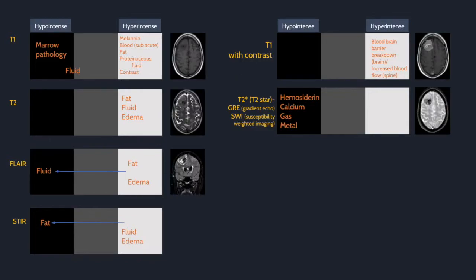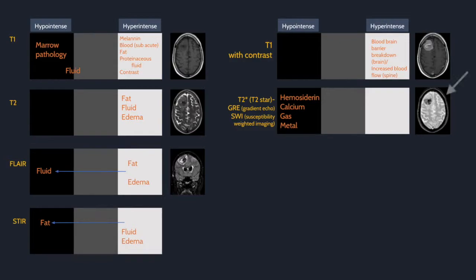Here are multiple axial and one coronal image of the brain. In this T1-weighted sequence, the subcutaneous fat and fat in the marrow are bright, but the fluid is dark, and gray matter is darker than white matter. We see a mass in the right frontal lobe altering the local anatomy. With contrast, the mass is much brighter due to blood-brain barrier disruption, and the superior sagittal sinus is bright as it is filled with contrast. On T2, subcutaneous fat and marrow are still bright, but fluid is bright as well, with areas of increased signal near the mass that may be fluid or edema. The coronal FLAIR shows increased signal near the mass persists, while fluid in the ventricles is dark, suggesting edema. T2 star shows focally decreased signal — a blooming artifact — likely reflecting blood.